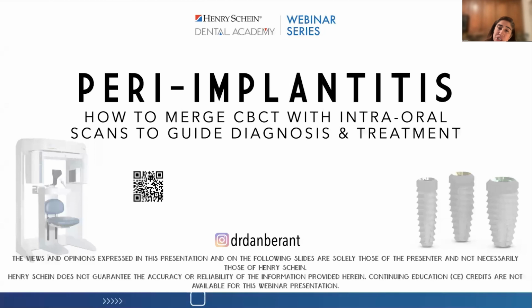Tonight's presentation is titled Peri-Implantitis, How to Merge CBCT with Intraoral Scans to Guide Diagnosis and Treatment.